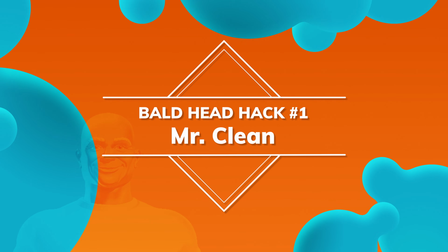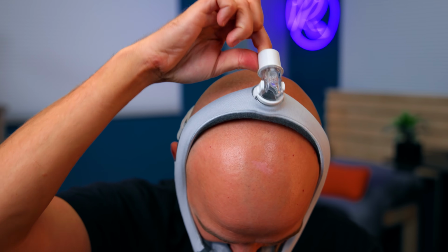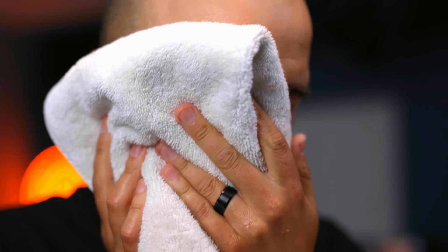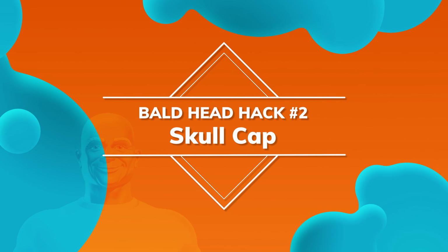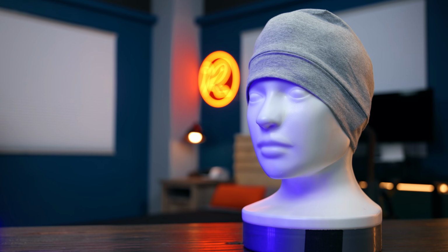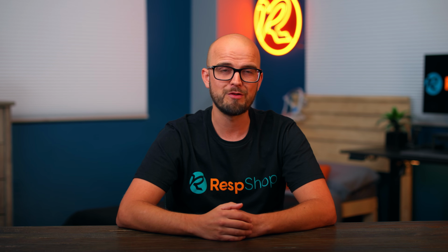Hack 1. Skin is usually more slippery than hair, and one of the reasons is the oils that the skin secretes. A quick wipe of your head can really help clean away skin oils and allow straps to get a better grip on your newly cleaned dome. Hack 2. Some find a soft skull cap can really help. These are thin, breathable caps that give the straps something to grip and so prevent the slipping problem.